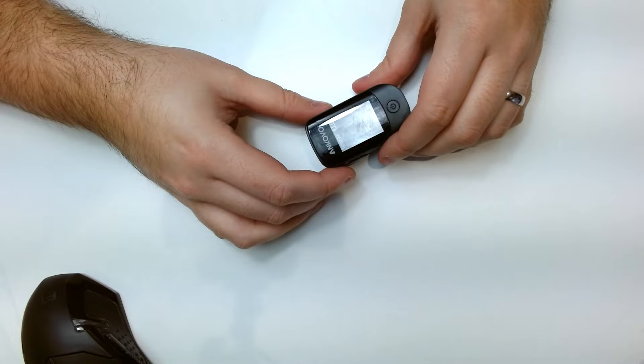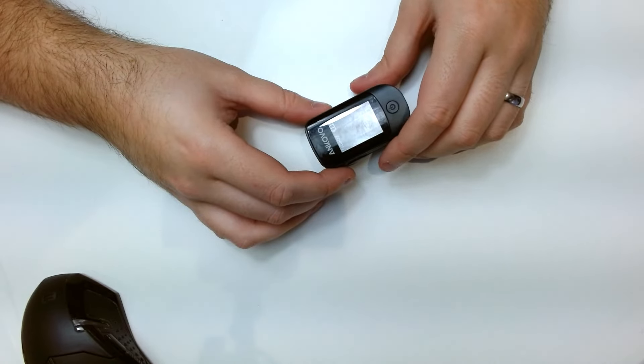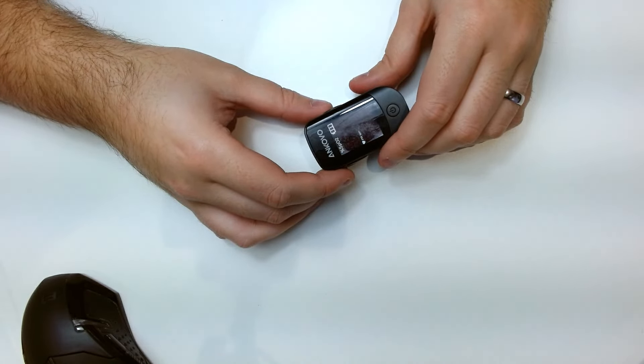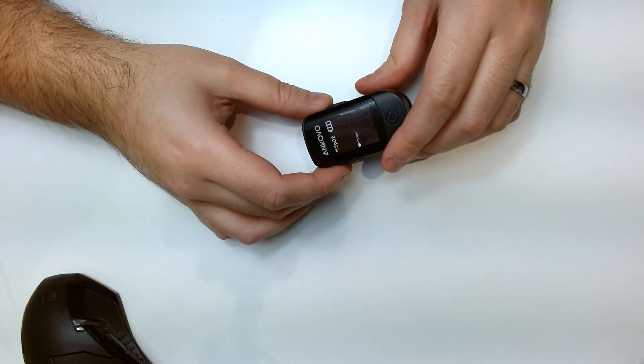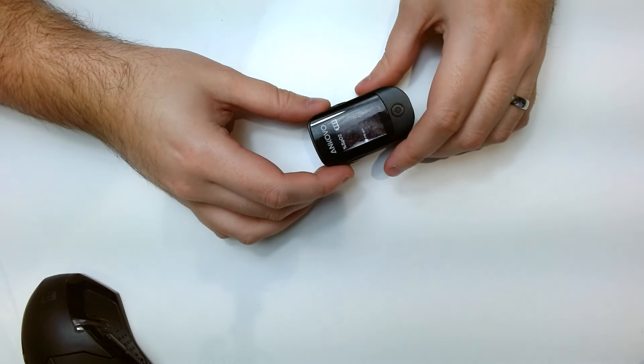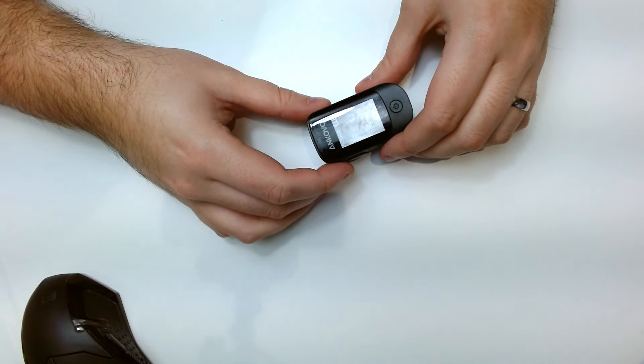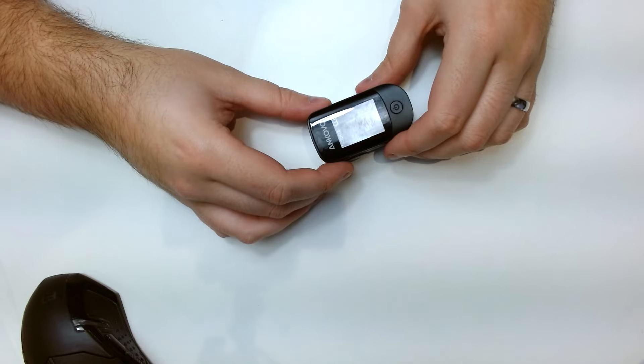Today I'm going to be reviewing the Pulse Oximeter Fingertip, the Blood Oxygen Saturation Monitor with Fast SPO2 Reading Oxygen Meter.